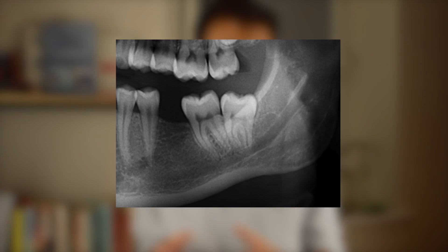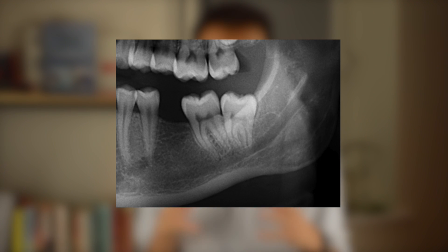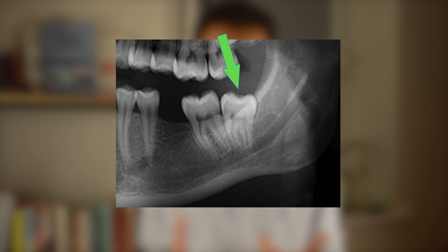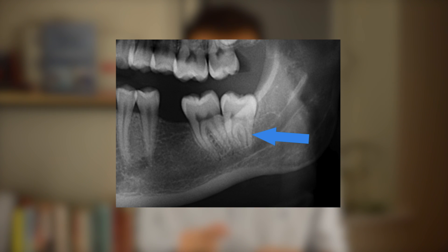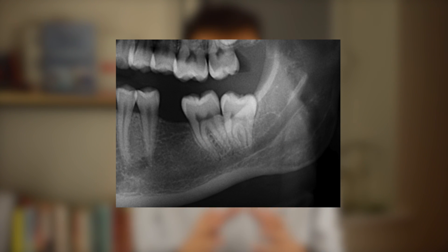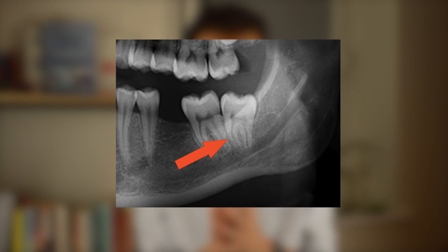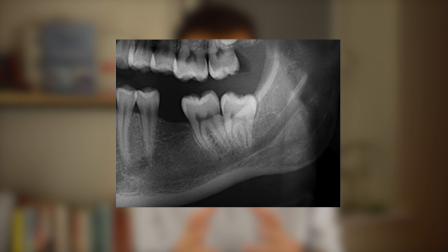Now let's look at some examples. Here we have a portion of an OPT demonstrating a lower left eight. Working through the mnemonic: looking at the crown, there's no obvious caries and the crown morphology looks relatively normal. Looking at the roots, I can identify two — a distal root that is relatively straight and a mesial root with a slight curve. The tooth is disto-angular, and that mesial root is very closely pressed against the seven, which may add complexity to surgical removal. Looking at the impaction, there hasn't been significant bone loss distally, so it is likely bony and potentially soft tissue as well.